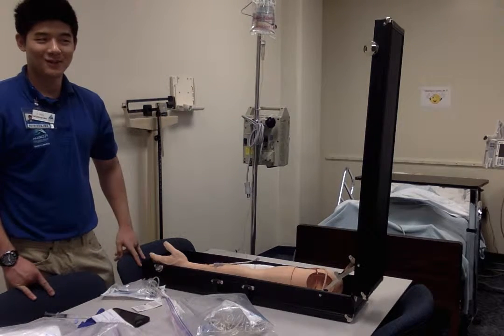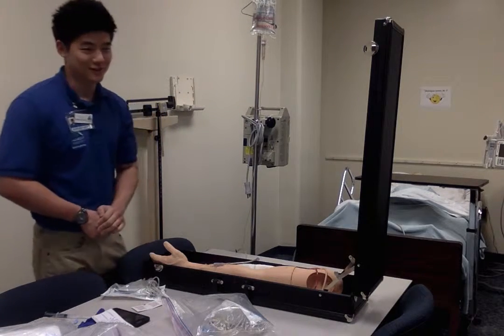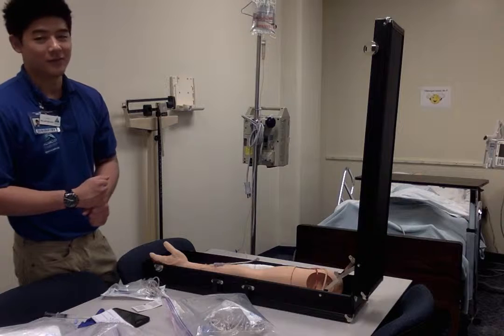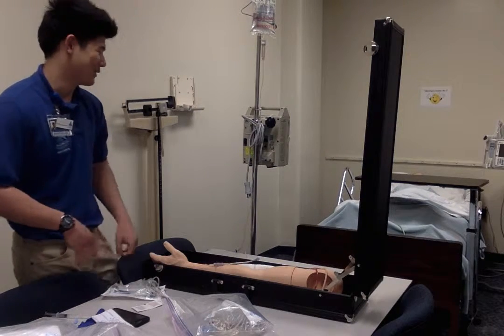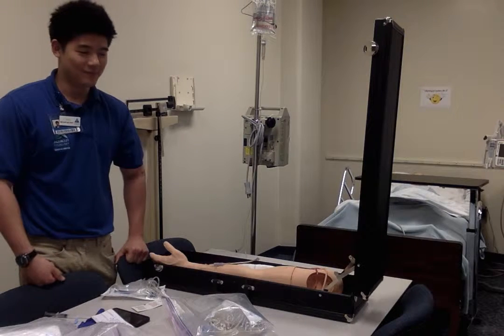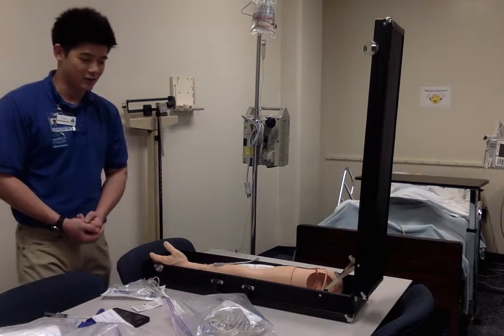So, first thing I'm going to do is go ahead and check my doctor's orders, make sure nothing is abnormal, and make sure that I have the right patient and the right medication and such.